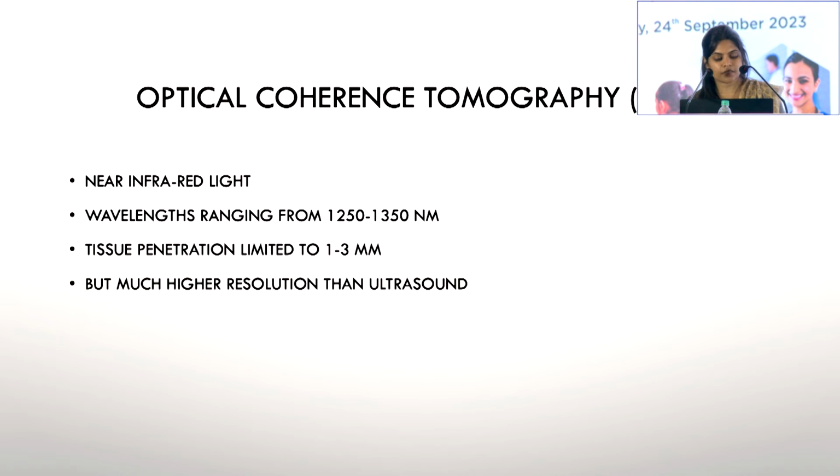It is just near infrared light. The wavelength ranges from 1250 to 1350 nanometer. The tissue penetration is limited, that is 1 to 3 mm, compared to IVUS, which has a better penetration. But the resolution is much higher than ultrasound and also the IVUS.